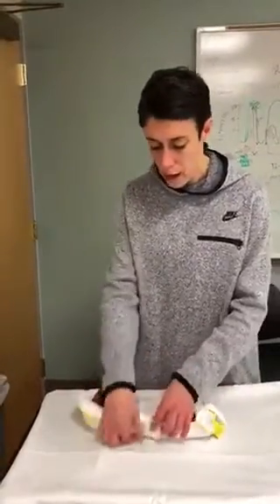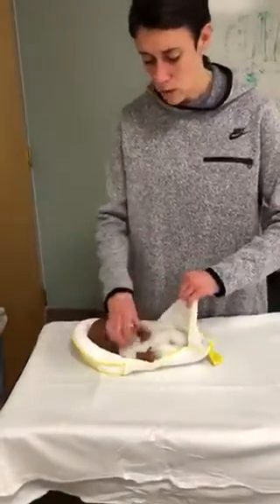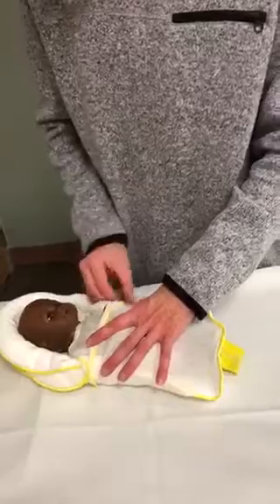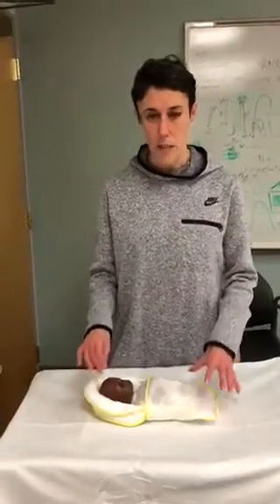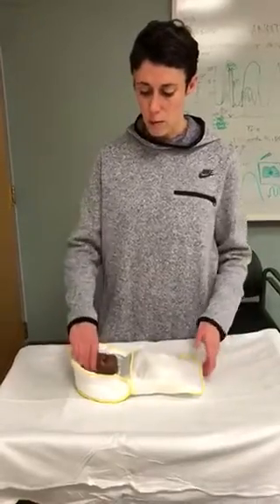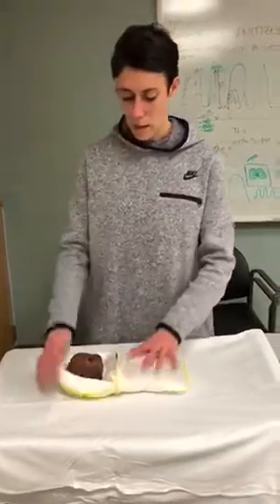If you want to avoid that, you can skip the arm strap altogether and just use the bottom layer, tuck their hands, and strap them up. Then they're getting good light — just going through one layer throughout their trunk, with exposure pretty much from the shoulders up for the face. These positioners are going to be really infant-specific after discussing the plan with a physician for those kids that are super disorganized. You can bring the sides up to give a little bit more visual occlusion if you need that, and if you don't, the sides can come down.